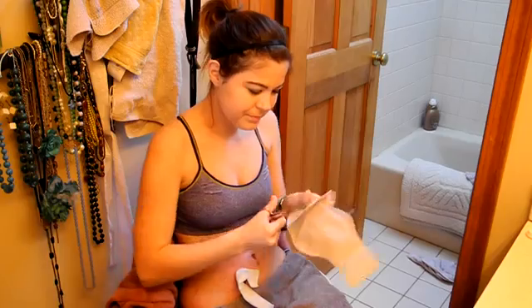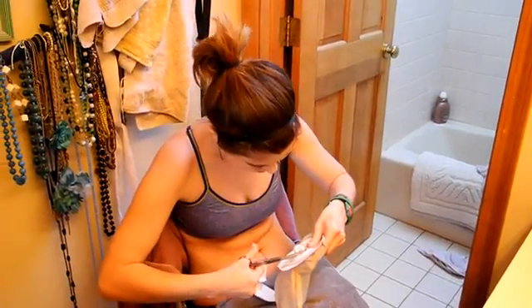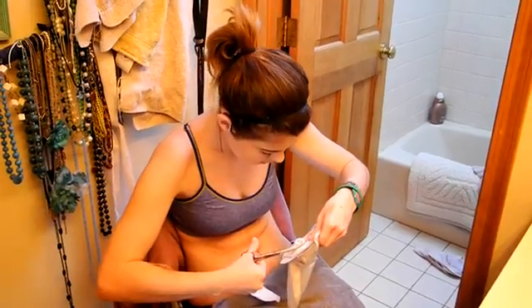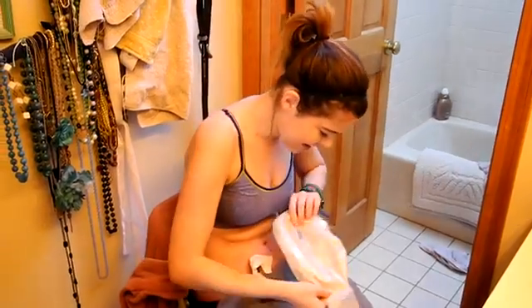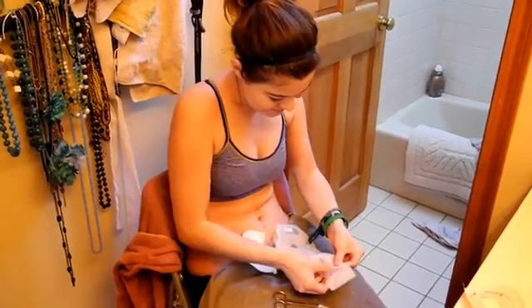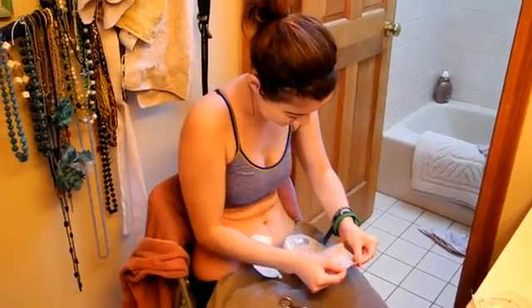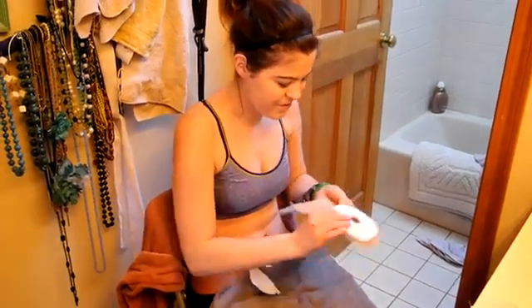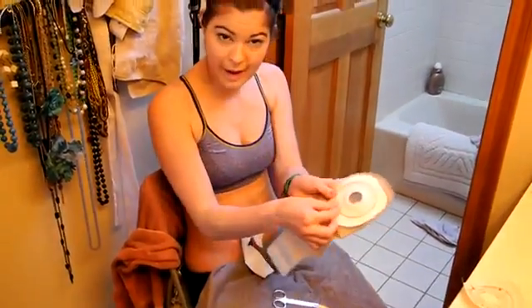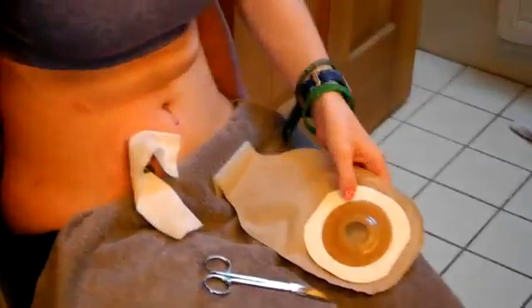So you just cut right around where you marked, and I'm going to cut it a little bit short because my stoma is a little oblong. Alright. Oops. That's never happened before. Make sure that it gets out of the bag. Okay. So then what you do is you pull away, and just like that, you throw that away.